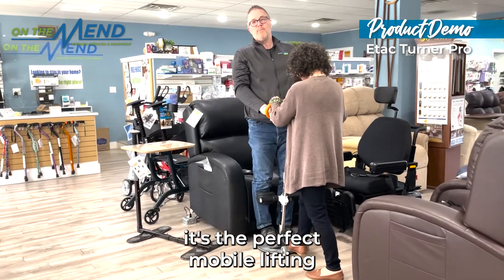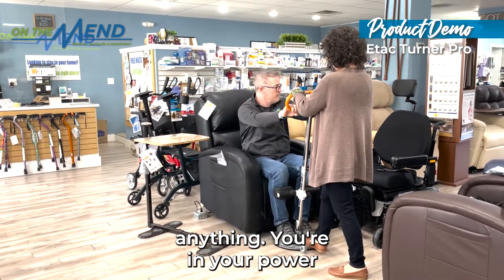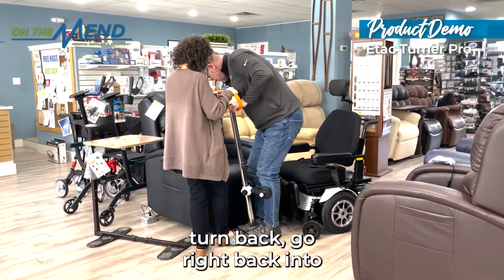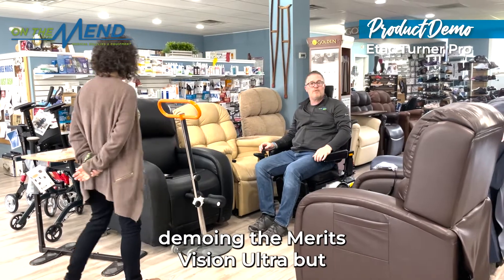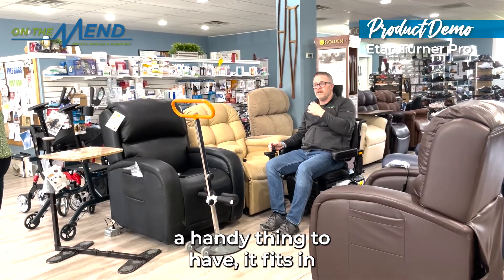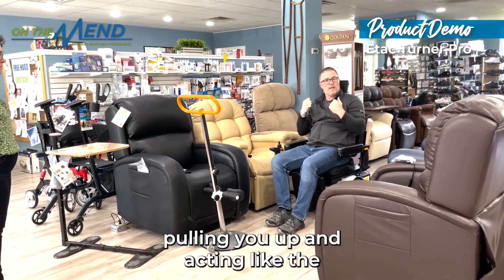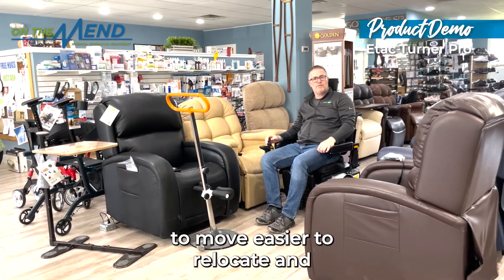You can bring it anywhere — it's the perfect mobile lifting device to help somebody get up and down. Whether you go to visit your grandchildren, you're in your power chair or wheelchair, you can go from that and spin right back around. The E-Tac Turner Pro, along with the Meritz Vision Ultra we're demoing, works with any power chair or wheelchair. It fits in cars, helps you be mobile, and ensures your loved one or caregiver isn't extending their back pulling you up and acting like a human lift machine. It's non-powered, easy to move, and easy to relocate.